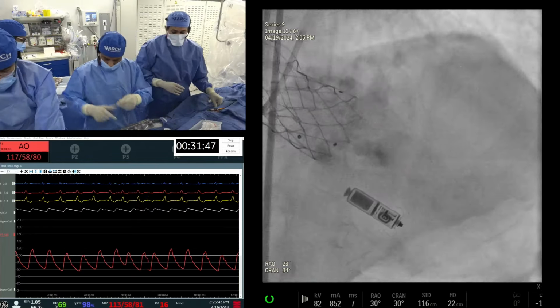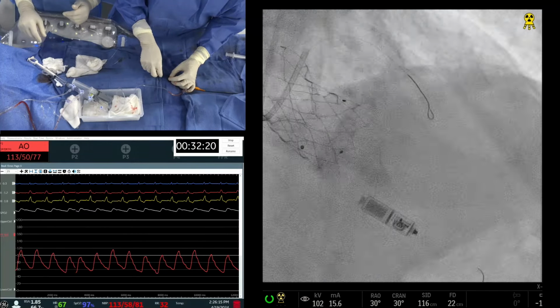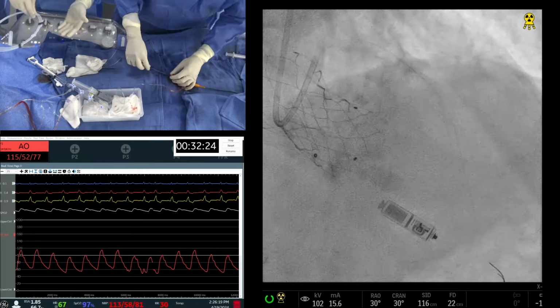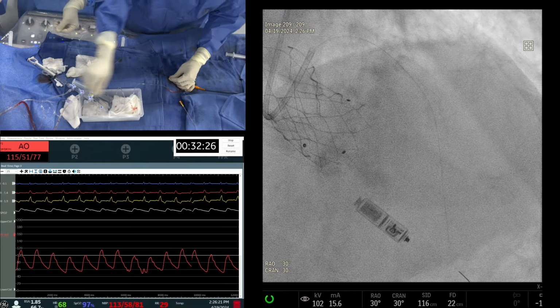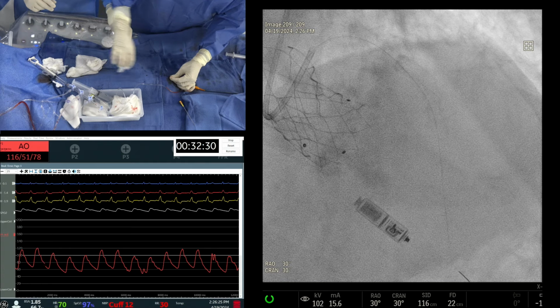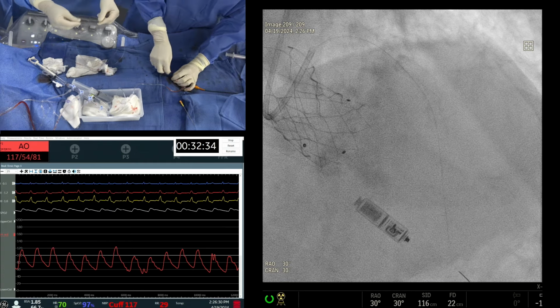And you can touch it back with lithotripsy in the nodule too and crack a little bit more. You may shave off the nodule. Sometimes because of wire bias, you may actually shave it off less. So your bigger burr most likely did the damage, but you can actually touch it with the shock wave if you were able to go into the diagonal. But the diagonal shock wave will likely be 2.5. Yeah. We may need a larger one for the LAD.